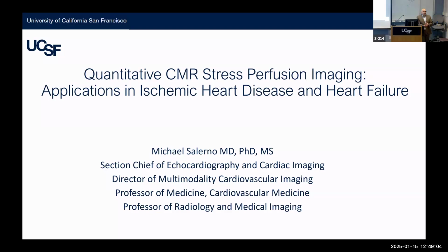So I think there's an opportunity to increase use, but the biggest issue in my mind is still having access to the technology and controlling some part of the schedules that do these studies. In reality, going from an MRI to a stress MRI is essentially adding a little extra time to regular MRI. So it's actually not that much harder to do a stress MRI than a regular one.